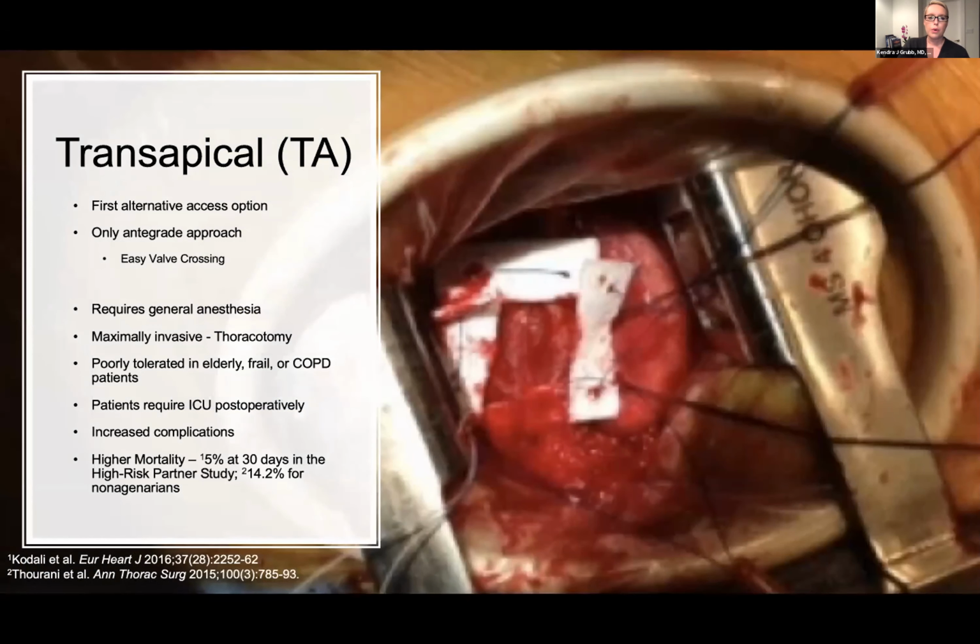A transapical approach was really the first alternative access option for the PARTNER trial. As you can see here, it requires a maximally invasive mini thoracotomy. It's the only antegrade approach that was really in the trials. It makes it very easy to cross the valves, but it requires general anesthesia. It's poorly tolerated by elderly, frail patients, especially those with COPD.